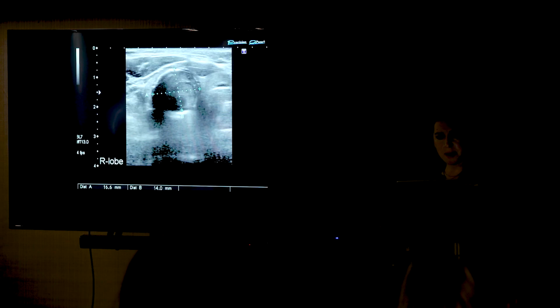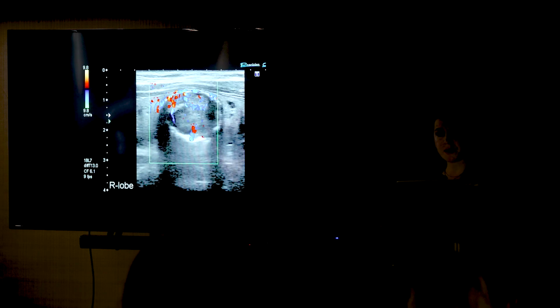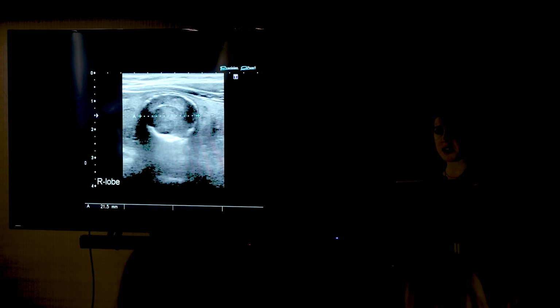And we were talking about calcification here. So although it is rim calcified, you can see within it. So it's hypoechoic and looks solid. And then we could demonstrate some internal vascularity. So again, it's alive. It's vascularized soft tissue in there. So a bit tricky though, because it's a bit contradictory which U value.